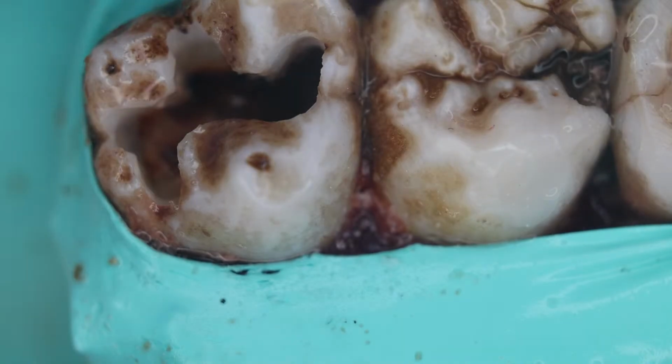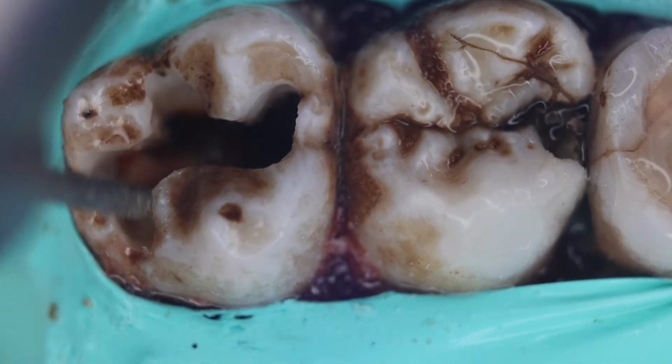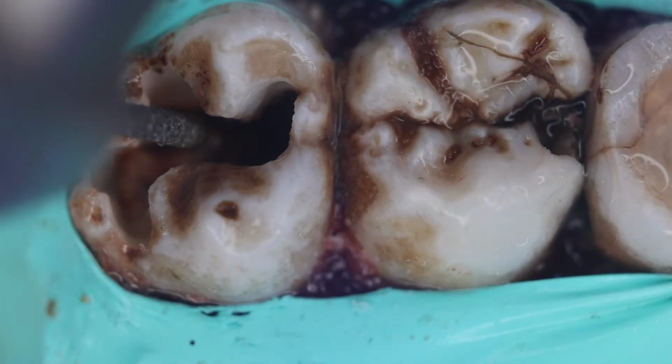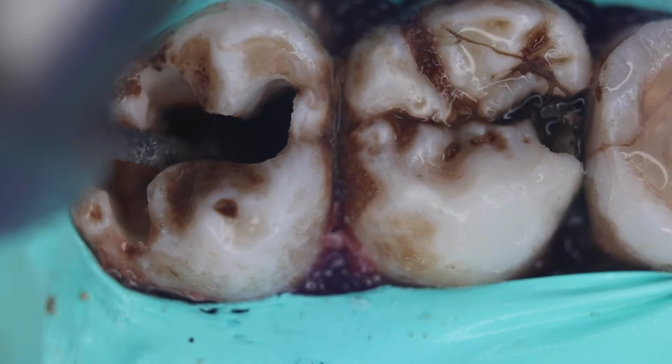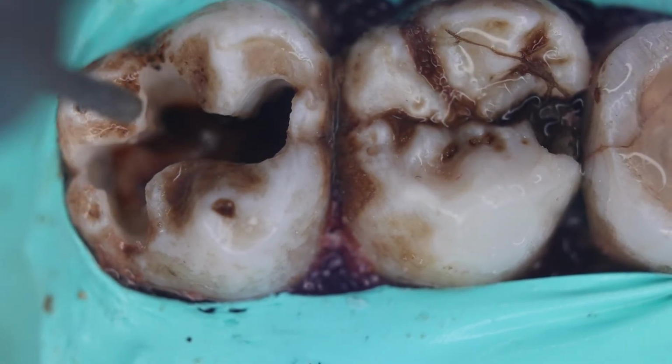So we have taken the straight fissure burr now, and we are just removing the caries and describing the external or the outline form, and we have already established the initial depth that we need, and we would not go much deeper until and unless we remove the caries.